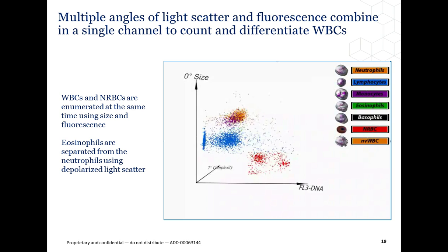Nucleated red blood cells are the first classified using this approach. And you can see, looking at their fluorescent characteristics, how they stand out, and all the events that are in the DNA column that has that particular value plus size are classified as NRBC.